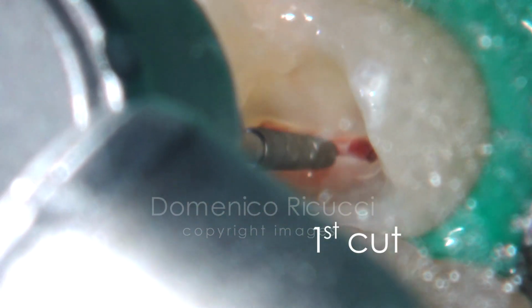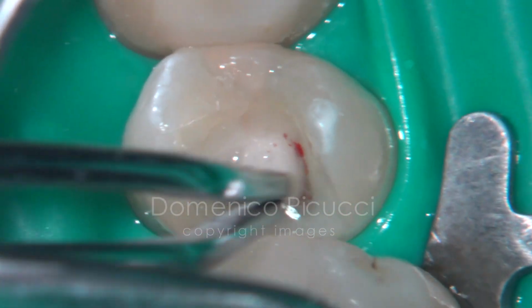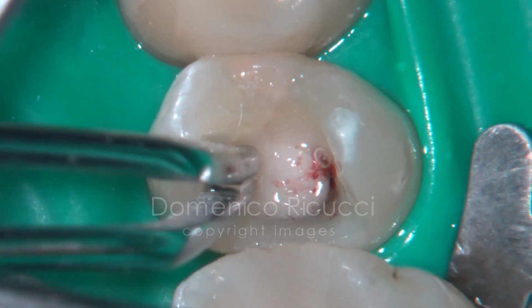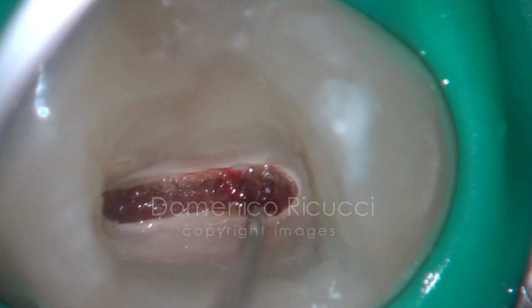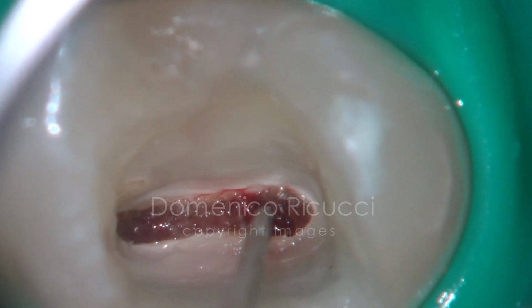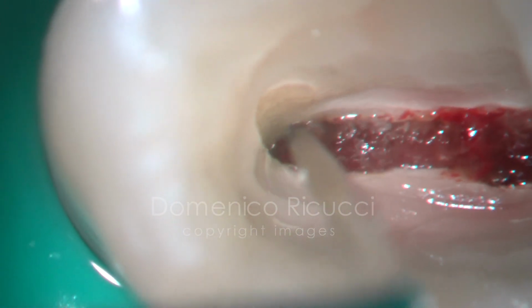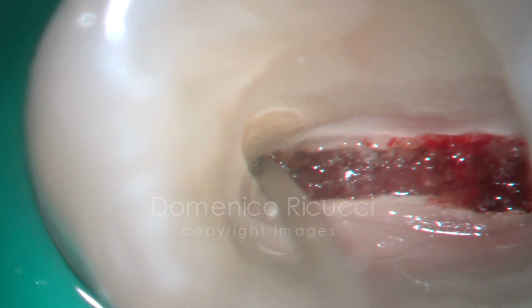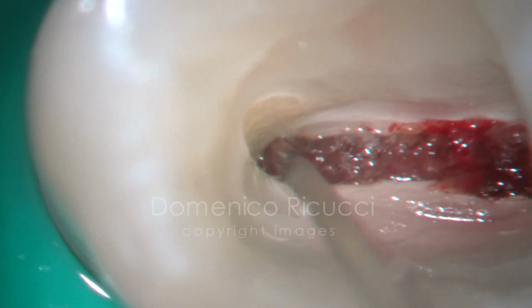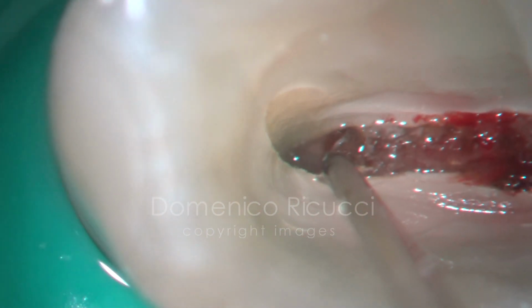The pulp chamber roof is removed and a first layer of pulp tissue shaved off. Hemostasis with sterile cotton pellets. The resulting wound is carefully examined. Gentle probing reveals that the pulp is detached from the pulp chamber wall, and this seems to be a negative prognostic factor. This wound is not homogeneous and is not considered optimal.